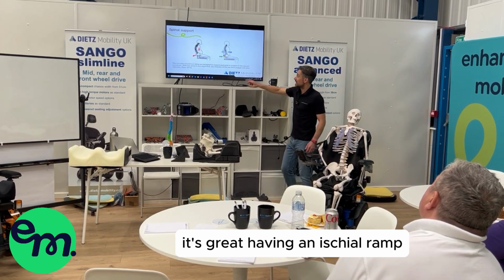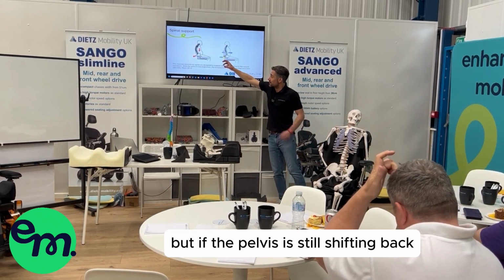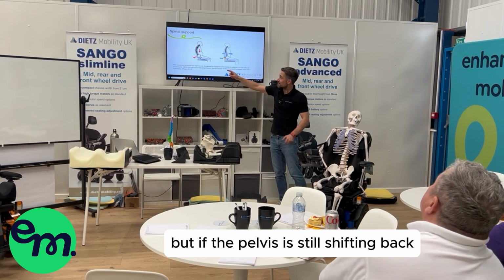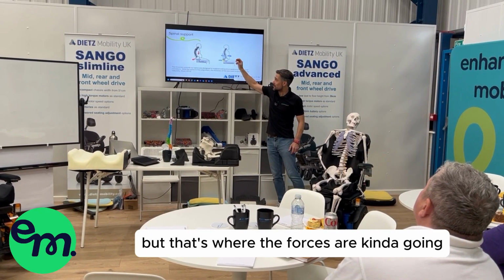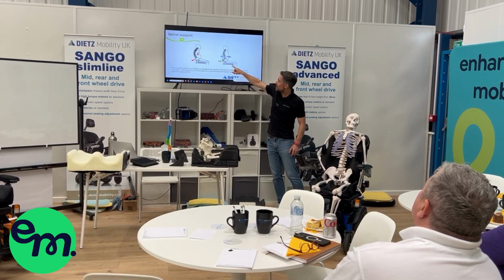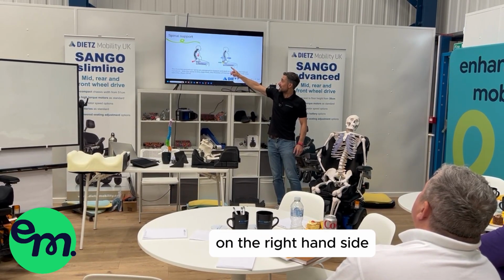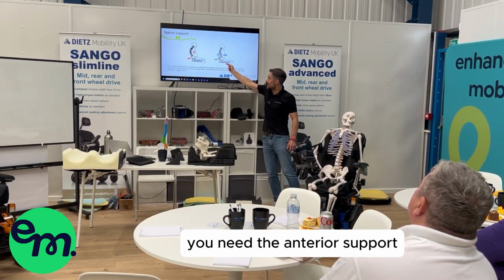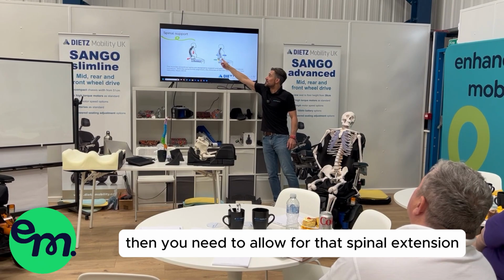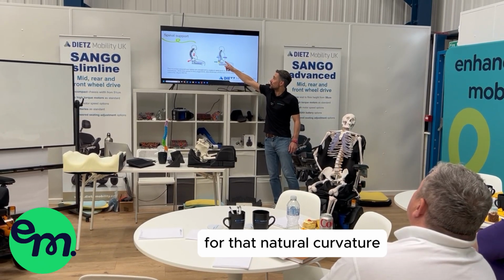It's great having the little ischial ramp, but if the pelvis is still shifting back, the IT is going to sit up against the ischial ramp, but that's where the forces are going. So the little example here on the right-hand side is blocking the back of the pelvis. But by blocking the back of the pelvis, again, you need that anterior support. And then you need to allow for that spinal extension, for that natural curvature.